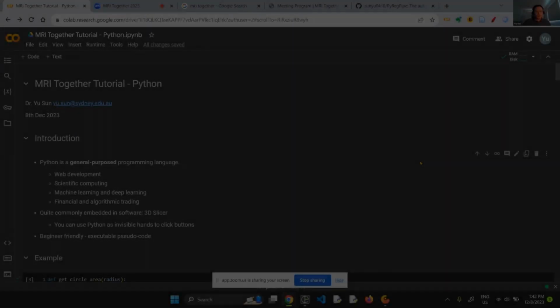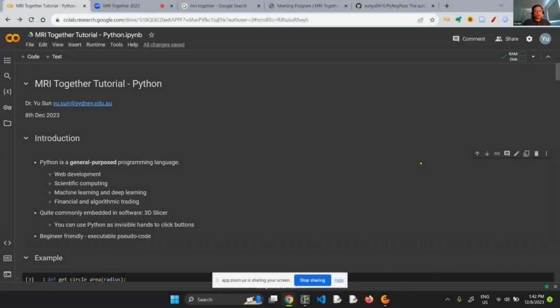A few months ago, Erin invited me to do this Python tutorial, and I asked how long it is, and she says 1 hour. Okay, I said 1 hour. Usually we would do around 3 hours for this. So I'll try to think about what to put in this 1 hour, so people with different levels of Python or DICOM image processing experience can benefit a little bit.